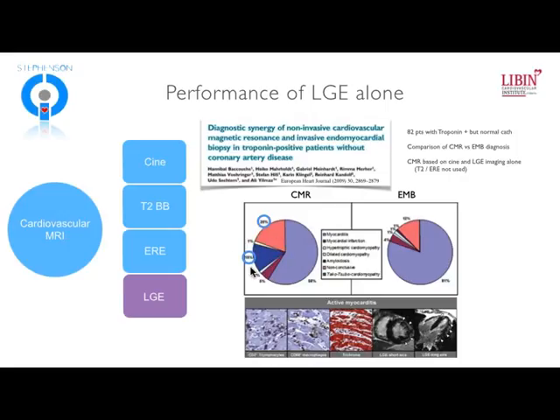In fact, we see a similar prevalence of myocarditis, although a little bit less in CMR, predominantly due to this group here, which was called Takotsubo cardiomyopathy. And that actually just brings into question whether or not endomyocardial biopsy is the appropriate tool to diagnose that, and actually makes us wonder about the pathophysiology as well, that it may actually be inflammatory.